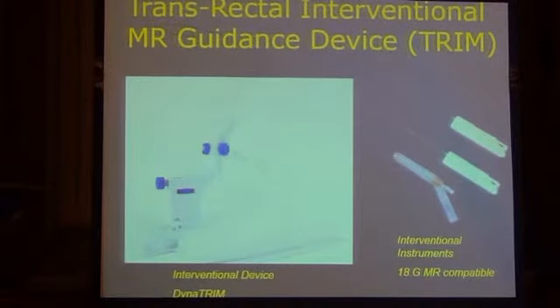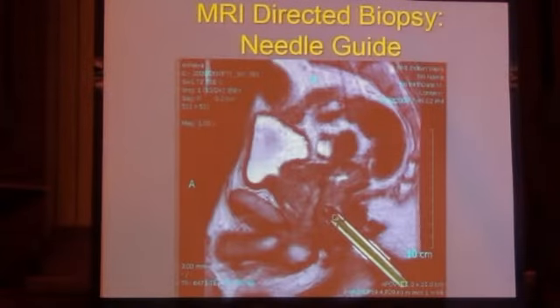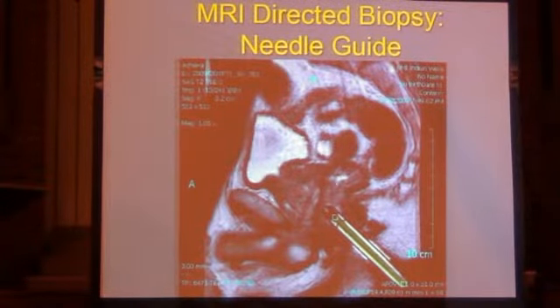That's it. The interventional portion takes about an hour. You're on the table for about 40 minutes. A lot of it's patient positioning, but they give IV Versed, so most people don't even remember what happened to them. So it's much more comfortable, believe it or not, than TRUS biopsy. One of the interesting things is, you know, I used to do this with demonstrations all the time and say, this is the needle guide.